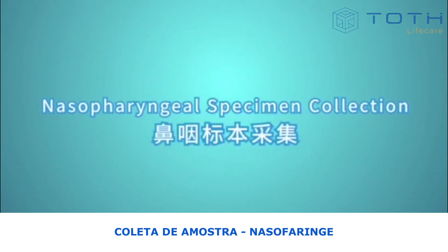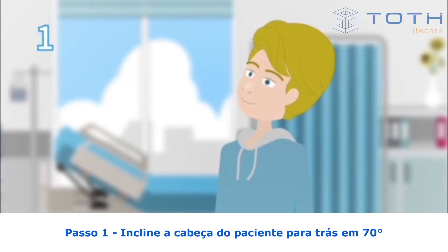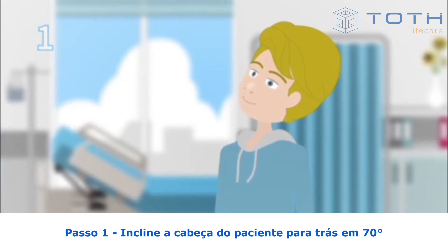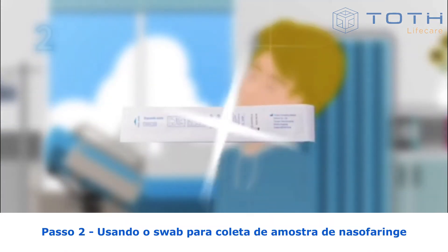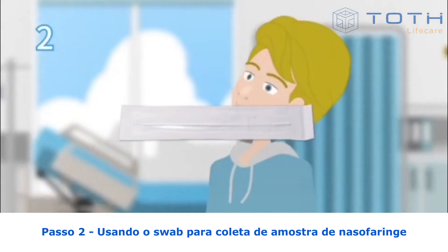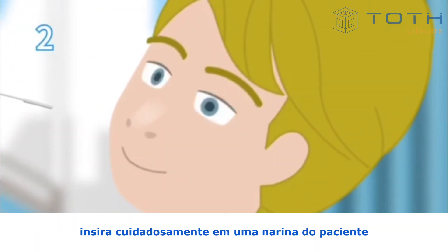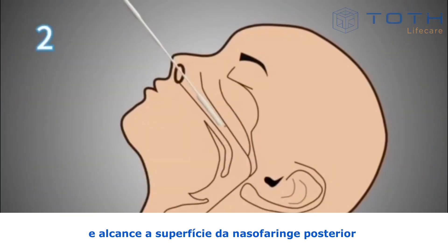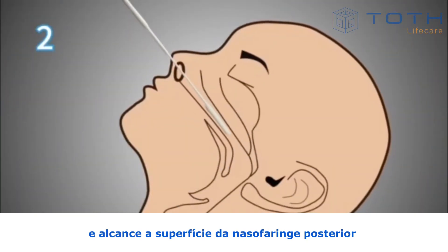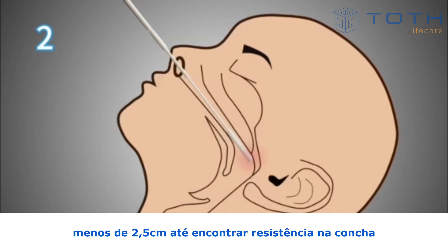Nasopharyngeal specimen collection, Step 1: Tilt the patient's head back 70 degrees. Step 2: Using the sterile single-use specimen collection swab, carefully insert it through one nostril of the patient until you reach the surface of the posterior nasopharynx — less than one inch — until resistance is encountered at the turbinate.